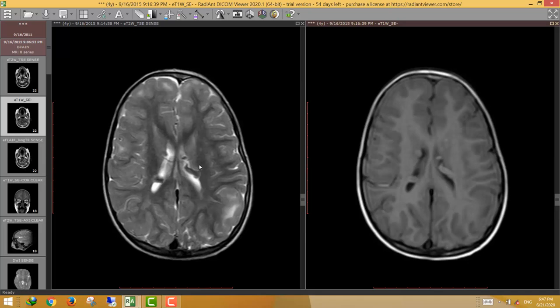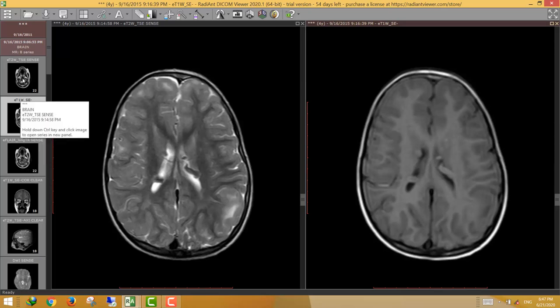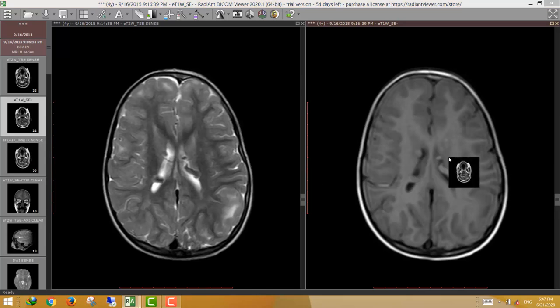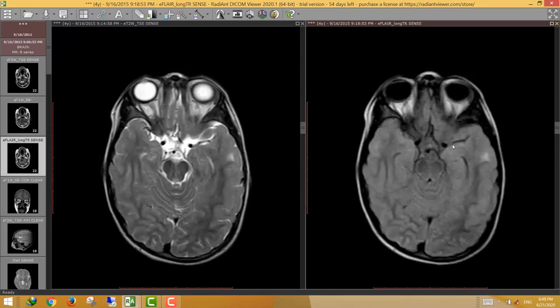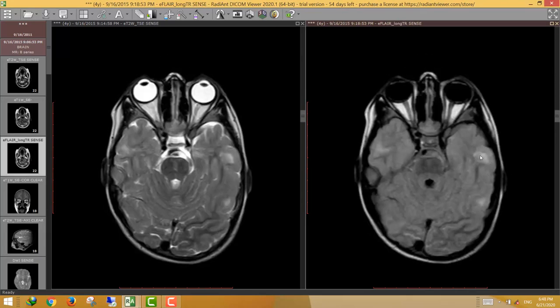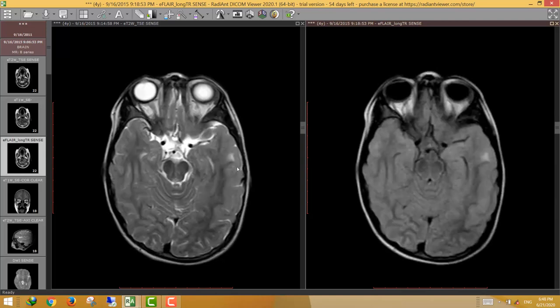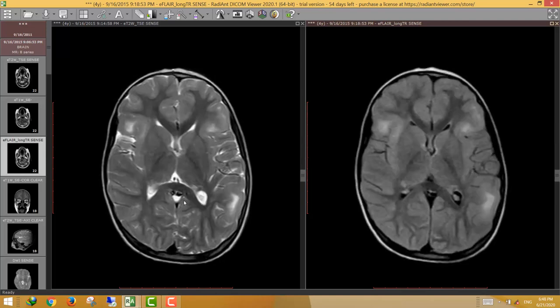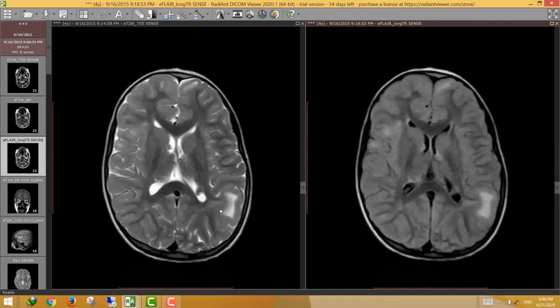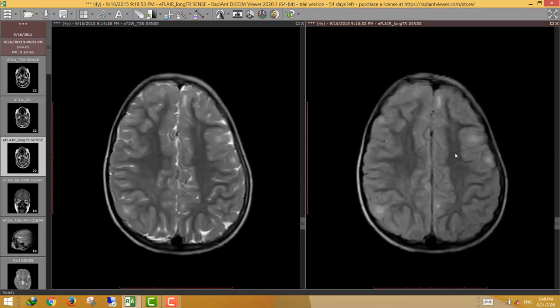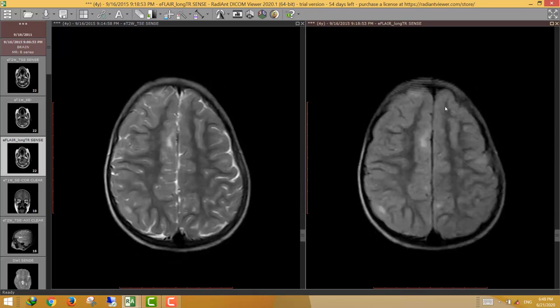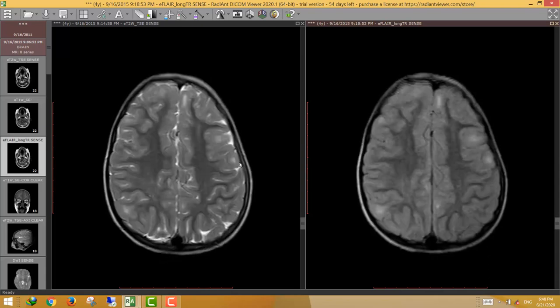Also in this case, we can see another finding on the FLAIR images: multiple bilateral subcortical areas of abnormal signal — subcortical areas showing high FLAIR and T2 signal.